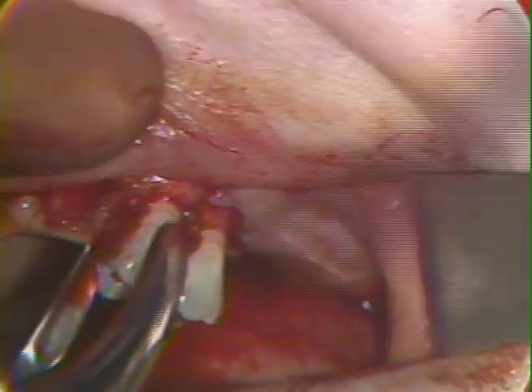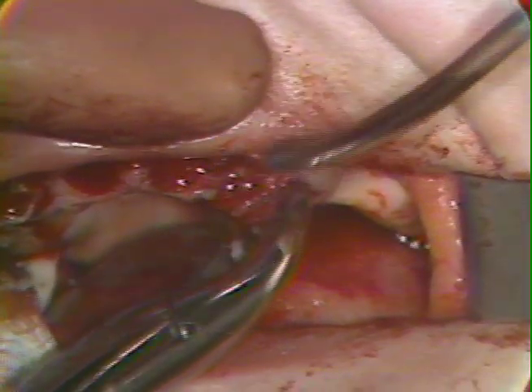Here, this very loose central incisor will rotate out with no difficulty. I think I'll confine my efforts for the moment to the bicuspids on this side, and we will eliminate the remaining teeth here, and we'll suction the mouth carefully. The assistant must be rather careful in keeping the field clear and the pharynx clear with a patient who is this far in a supine position.